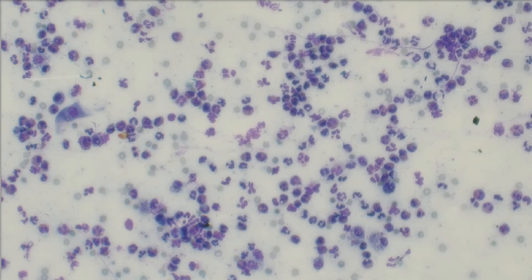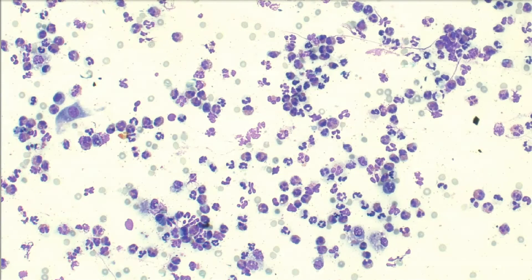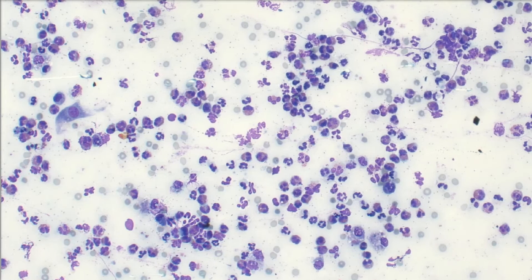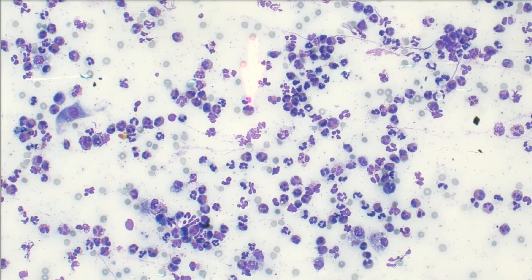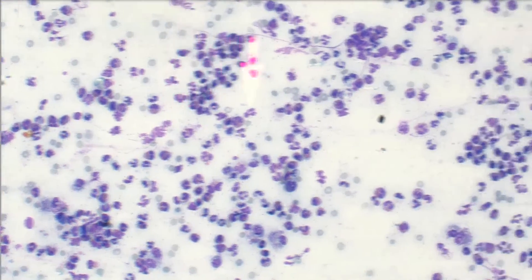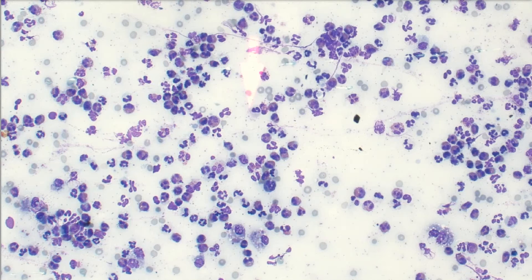Popping down a bit closer and brightening things up. This is an inflammatory party up in here, and can you see all of these pretty eosinophils? I hope you can see those. I'm going to get even closer so I can be sure that you see them. This is super inflamed — let's just go ahead to high power.